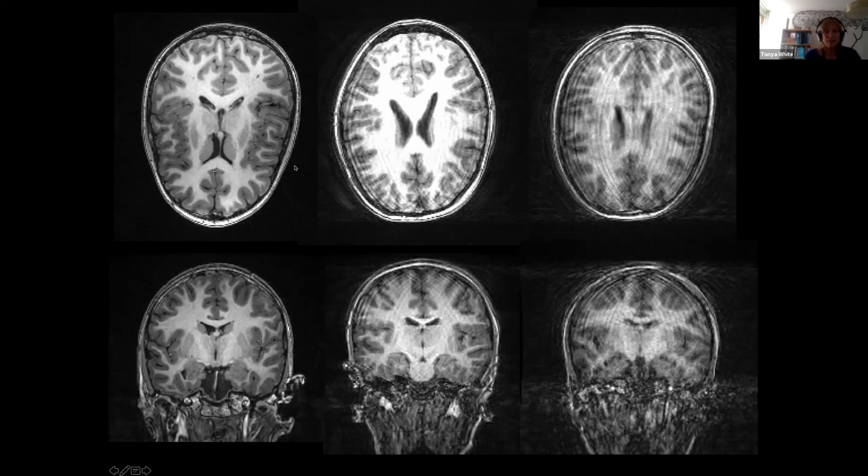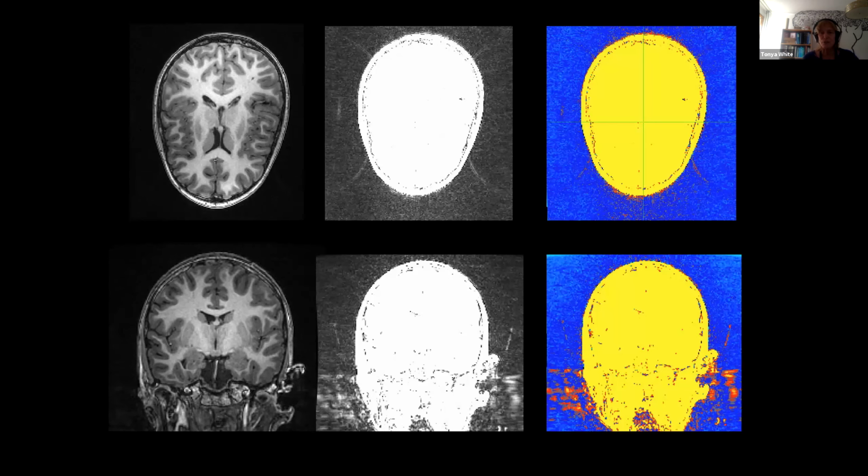So if you look at these 3 different images with good quality, medium, fair quality, and poor quality, both axial and the coronal sections, you see some change, some blurring of the signal outside the head into the noise. And that's what the earlier study, Mortamet, used. And this is just in color because I'm going to show you these different slides, but I'm going to do something different. What I'm doing here is, here's your original image.